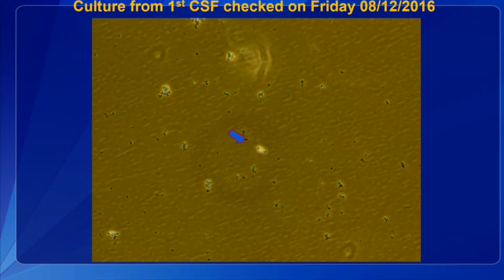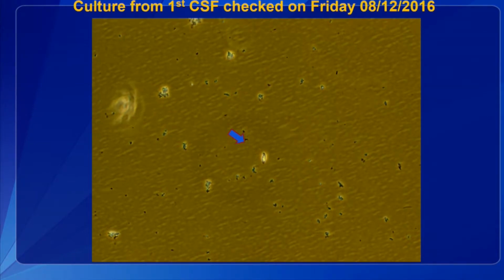And this is surprising, that we only saw 1 amoeba on Friday after inoculating it on Tuesday, and the number never got very high. The maximum I saw was about 10 amoeba, and they are not even growing very well. So we are trying to keep it in the lab, but still we haven't been very successful.